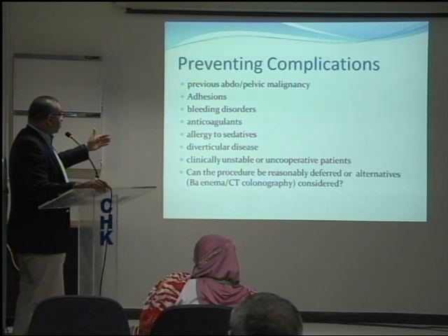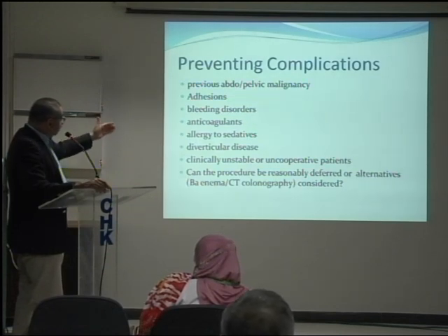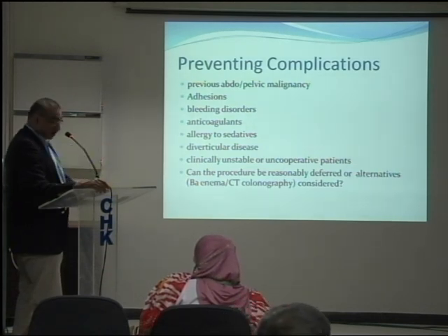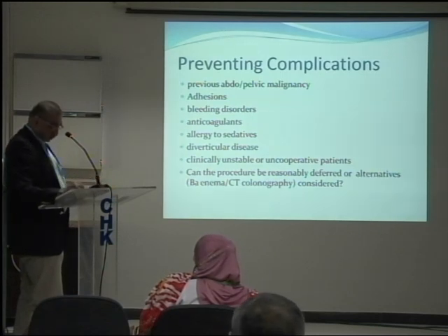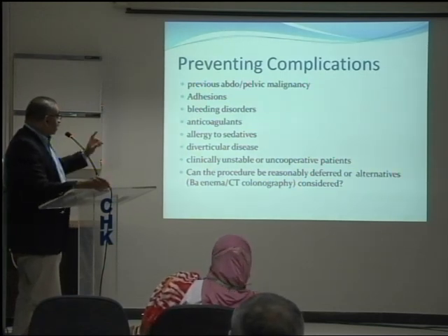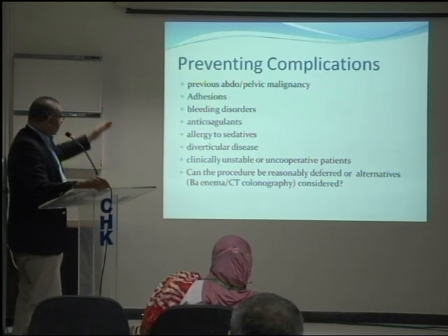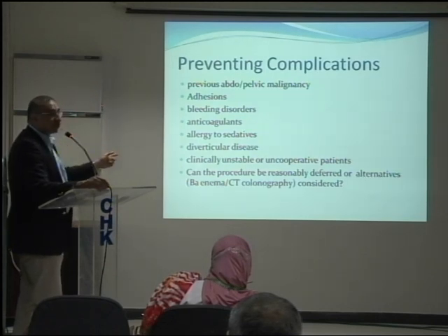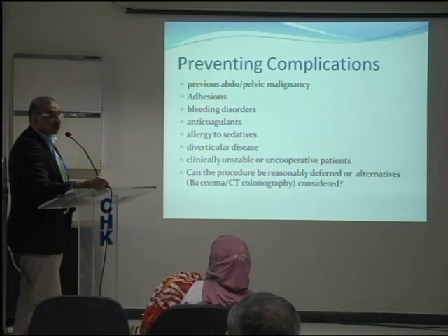Other conditions you have to be aware of should all be covered in your pre-assessment. If they've got an allergy to sedatives or they are clinically unstable patients, you shouldn't be doing them. The important thing is, if any of those high-risk features are present in the patient, can the procedure reasonably be deferred or an alternative procedure carried out, like barium enema? Barium enema is hardly done; they stopped doing it in our hospital. We do CT colonography.